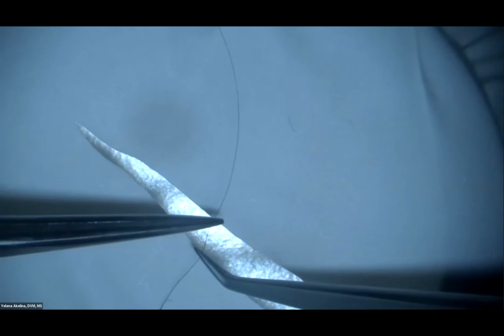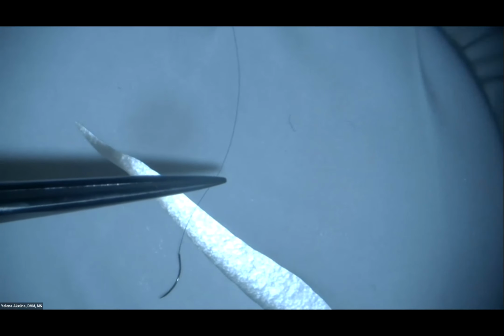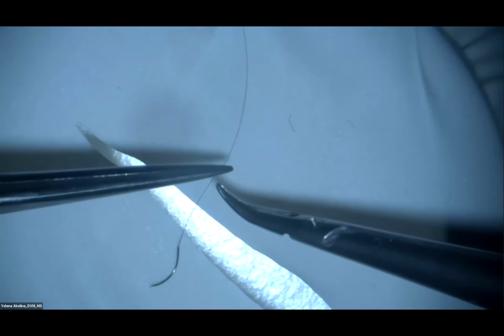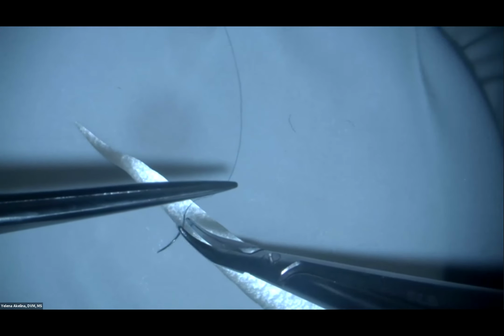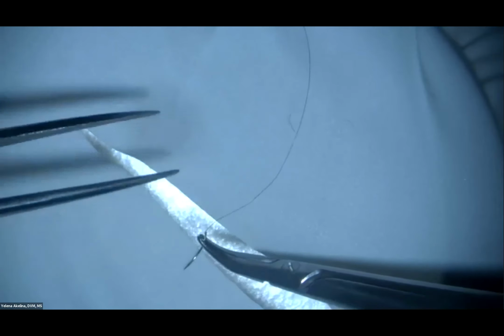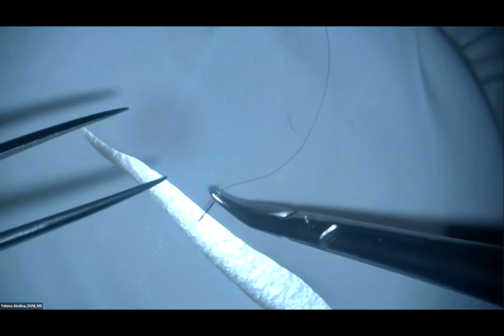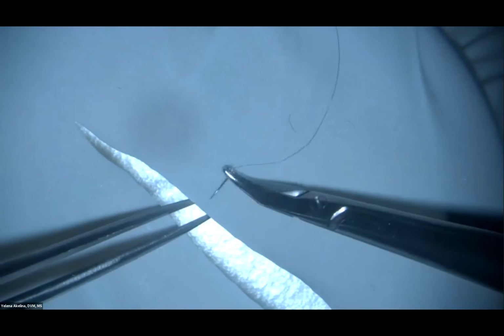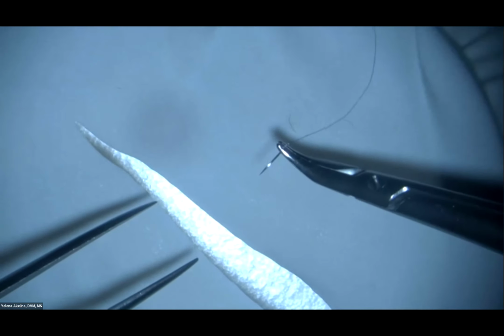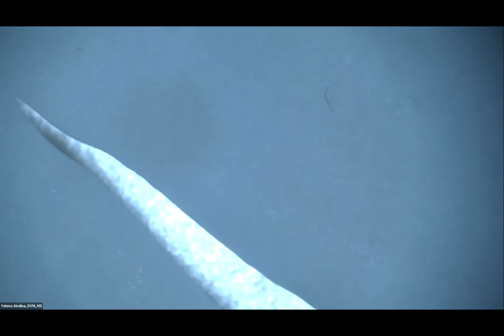So this is 9-0 nylon, and I can use the needle holder that is probably more familiar to all. You can see that I'm using the suture, not the needle, to load. This is what I do. You need 90 degrees. So again, using the suture, load the needle. You need a 90-degree angle, and this is a 90-degree angle entering. I can zoom in a little bit, maybe, in the scope, and put it in the middle of the screen.